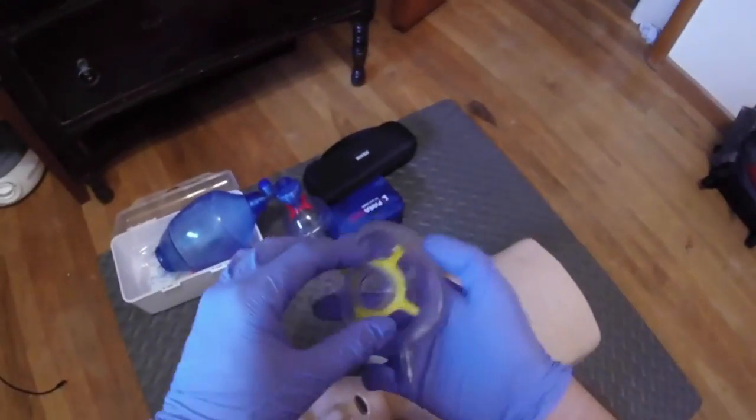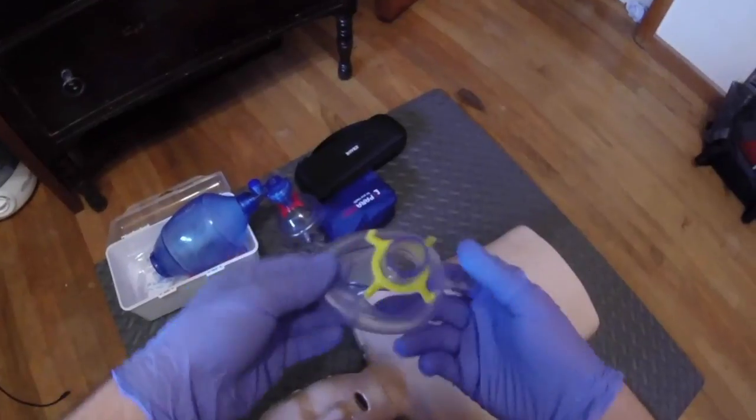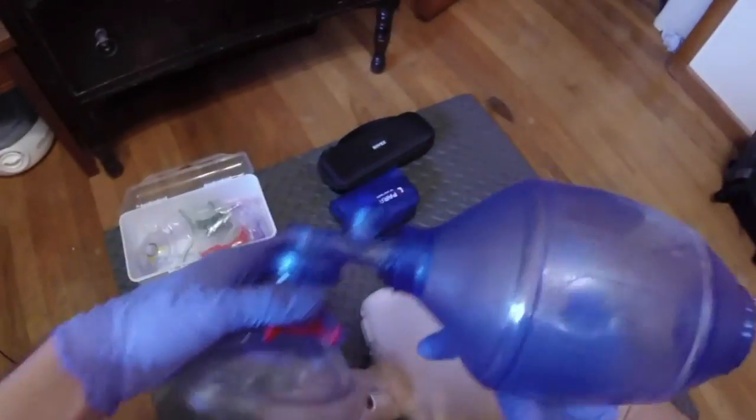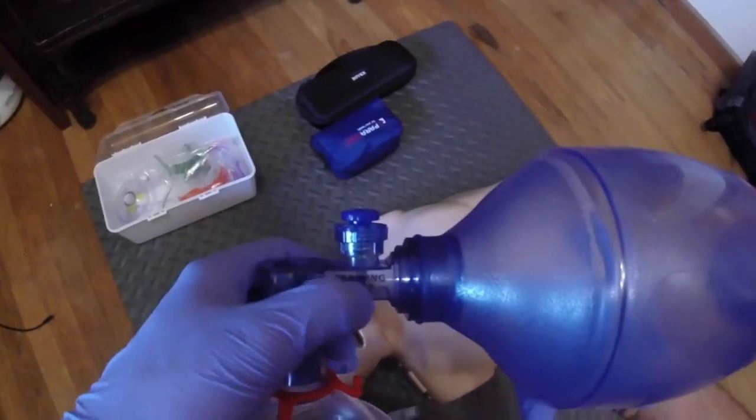This device also came with a pediatric mask, so I can use it on a pediatric mannequin too. This is only for training purposes — it says right there on it: training only.